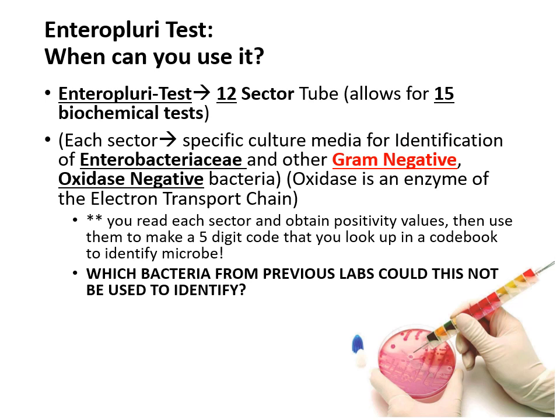So I want you to be able to answer that question if I asked you, could you use Enteropluri for identifying staph or strep? If not, why not? Explain that they are gram-positives, and this only works to identify gram-negatives.